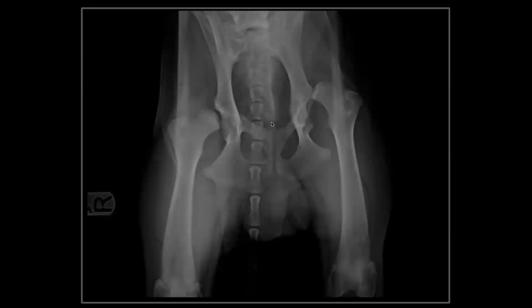Here we have profound disease on both sides. You wonder if the femoral heads were ever within the socket, within the acetabulums in this poor patient. And we have secondary thickening of the neck. We have secondary flattening of the femoral head. But we have severe dysplasia with secondary changes on both sides.